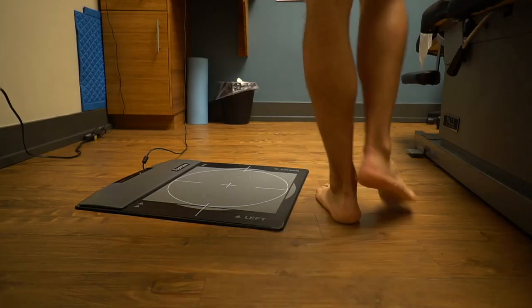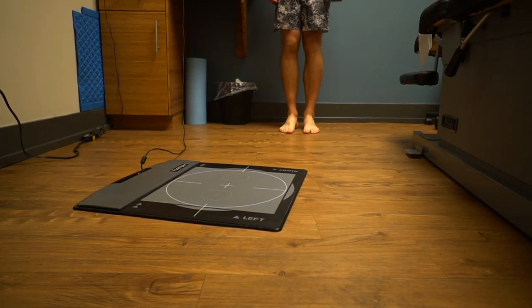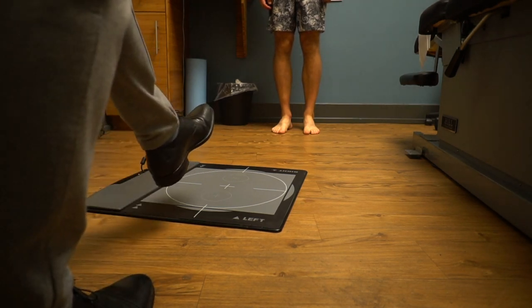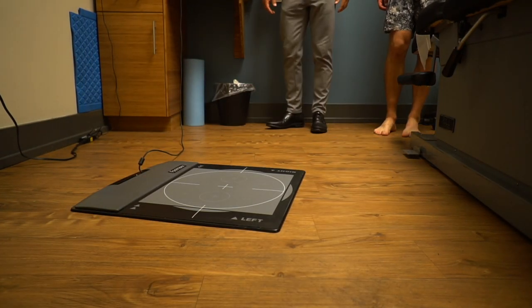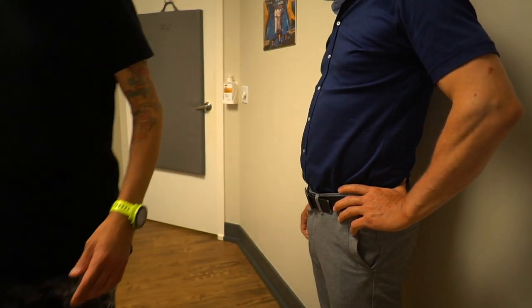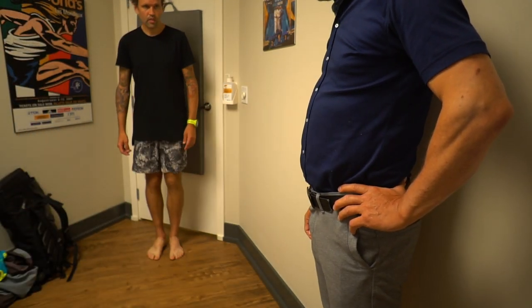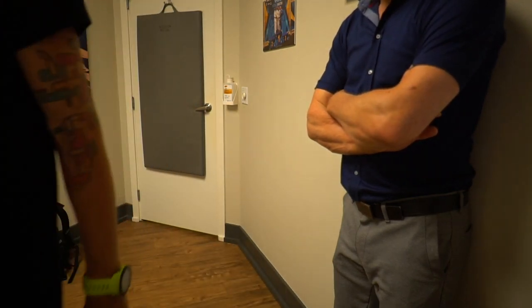We're going to teach you how to walk on here, so take your shoes and socks off. The idea is it's four steps — you're always going to start with the foot closest to the table. You take one step before you step on the mat, so it's right, left, right, left, and then pivot off that fourth step and stop feet together, then start again.